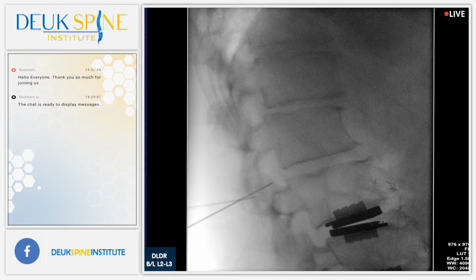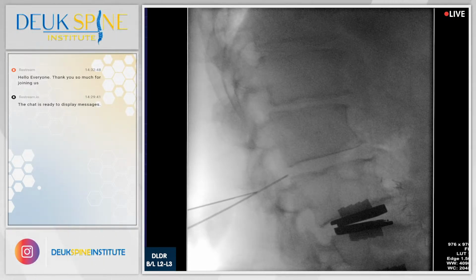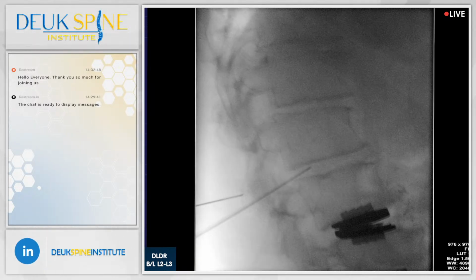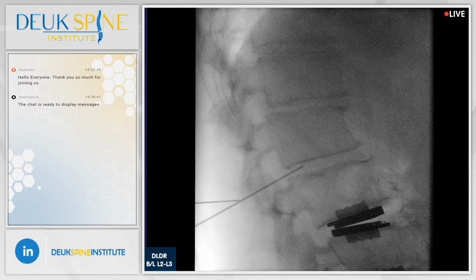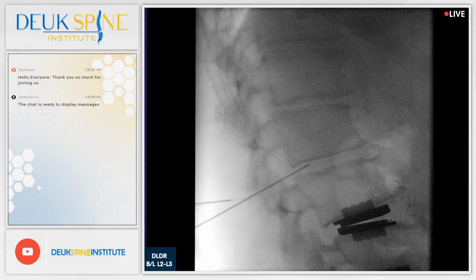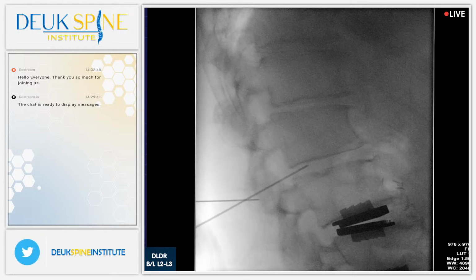All right, so I'm going to continue with the left needle, and I feel the herniation right there. I just touched it. And so we're going to enter this disc so we can fix this herniation. Now, I'm going to be testing this just to make sure it is the cause of his pain in just a moment. Shot. All right, first I would like to try to place the other needle at L2-3. Shot. So before I get started on the disc repair, I want to place both needles.